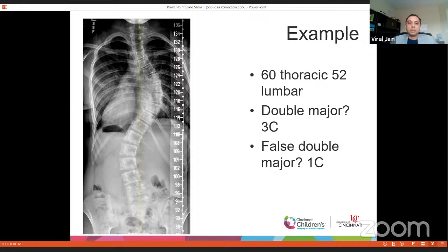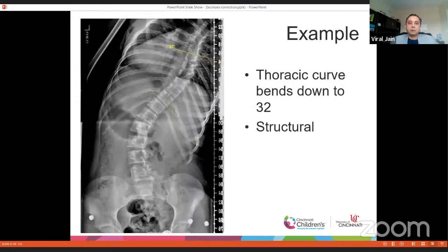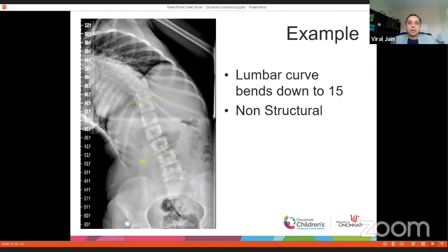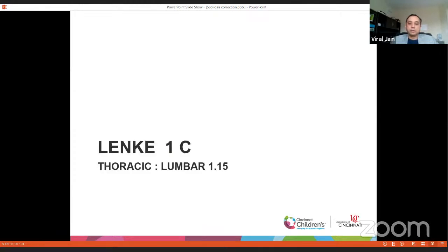In Lenke classification, this would be 1c. When you do a bending film, the thoracic curve by definition is still structural, but the lumbar curve bends down to 15 degrees, so it is not structural. This was a Lenke 1c curve, and the thoracic-to-lumbar curve ratio is 1.15 — we'll discuss that ratio a little later.